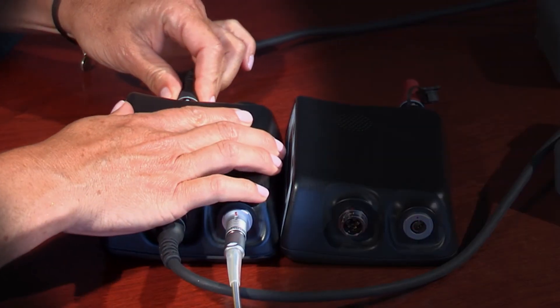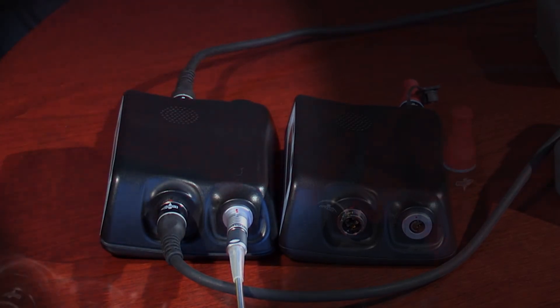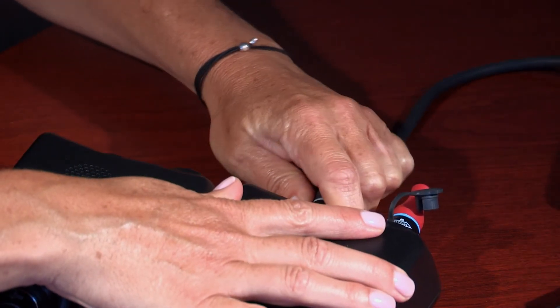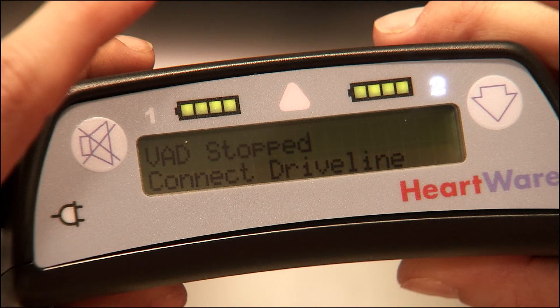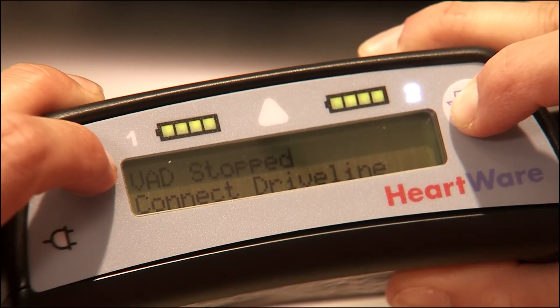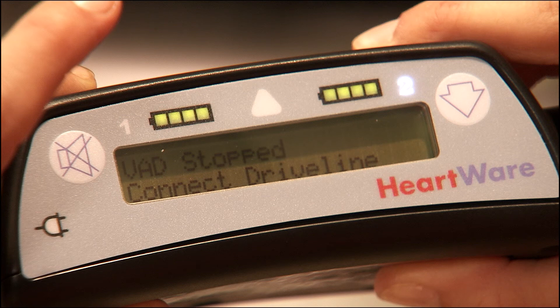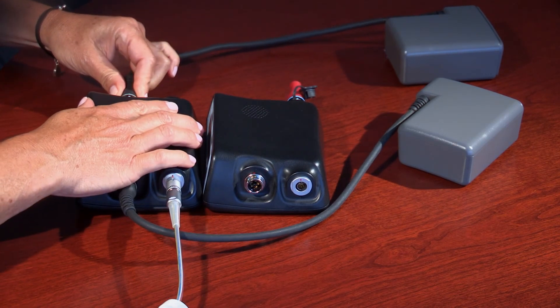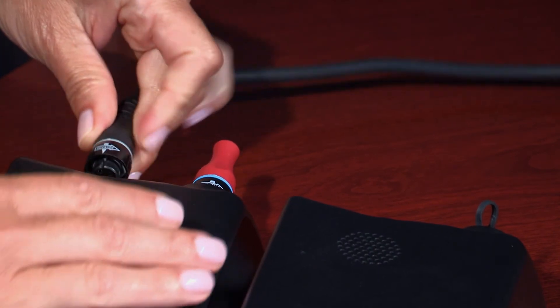The third P is for Prevent. Once you have verified that the pump is working, you can prevent the no power alarm from sounding on the original controller. If the alarm adapter is available, insert it into the data port on the original controller. You can then remove all power from the original controller and no alarm should sound. If a red alarm adapter is not available, silence the no power alarm by pressing and holding the alarm mute and scroll buttons simultaneously for at least five seconds, then release both buttons. You can then remove all power from the original controller. The fourth P is again for Power: connect a second power source to the new controller. If you removed power before silencing the no power alarm, reconnect a power source and follow the prevention steps.